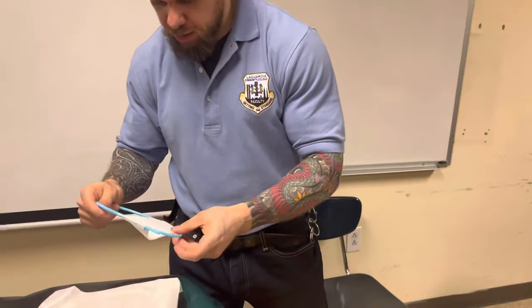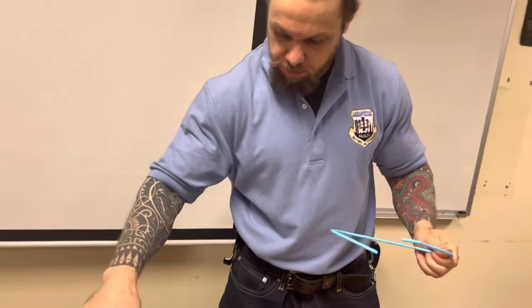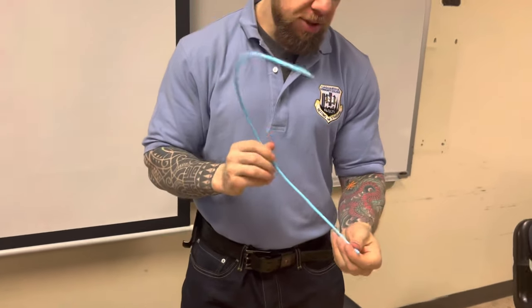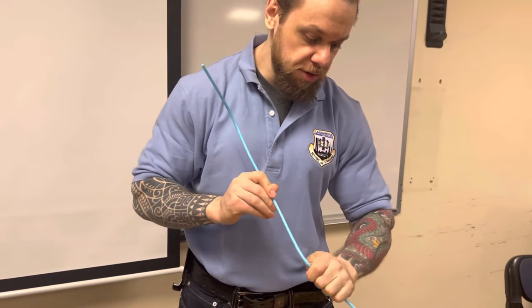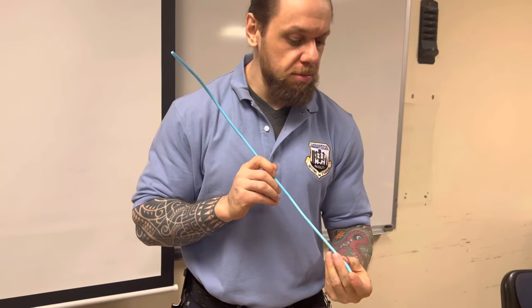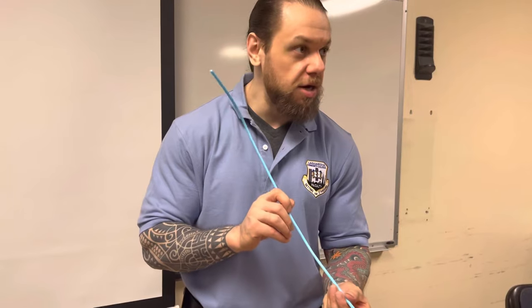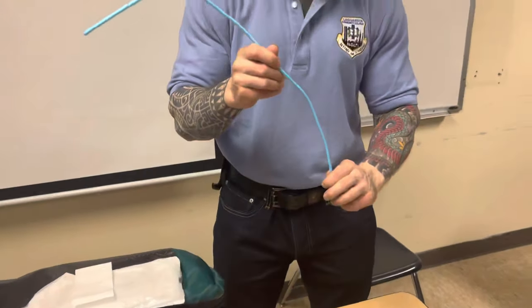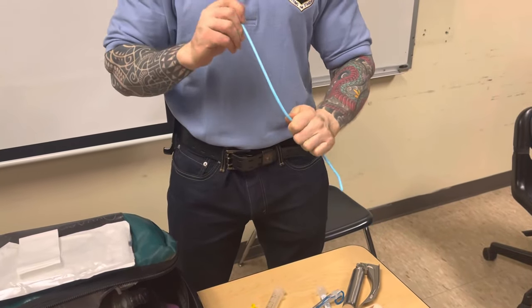You're going to get a bougie, and this is called the coude tip. Some videos or instructors will say you want to feel the rings, but truly speaking, the best landmark to know you're in the right place is holdup - this is not going to advance because you're going to hit the right main stem and it's going to stop. If I was in the esophagus, this would go all the way down. So holdup is the best marker.